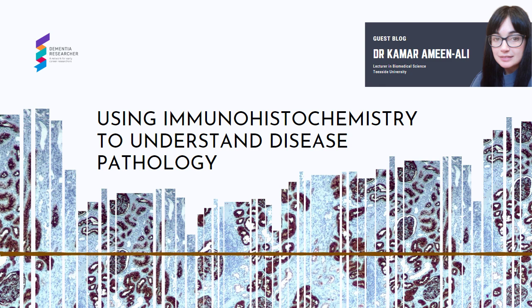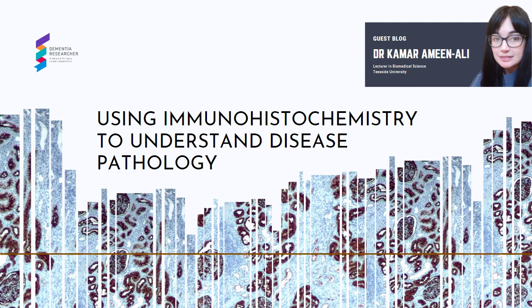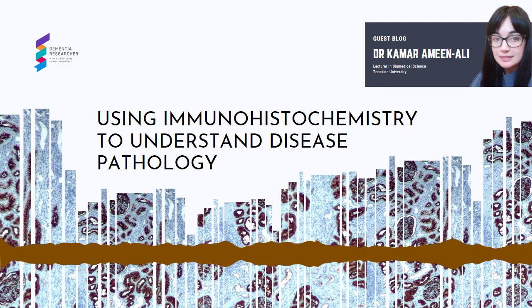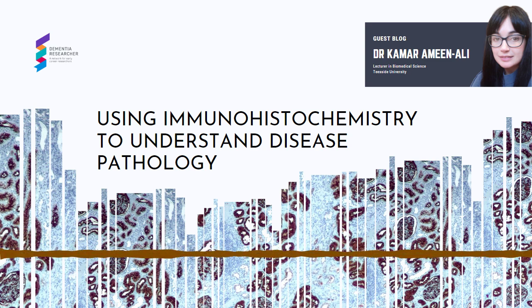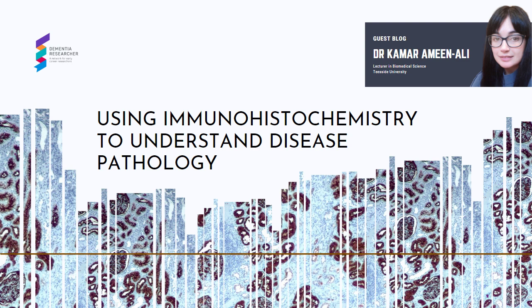Usually, established labs will have tried and tested protocols for many commonly used antibodies, which have gone through a process called optimization. This is where each step of the protocol has been tweaked to maximize the positive specific staining and minimize any background staining, which can happen when there is weak binding to non-specific proteins, which may have similar bindings to the target antigen.